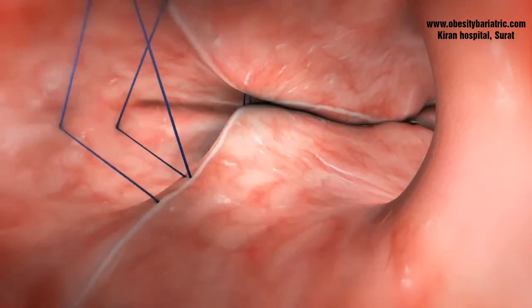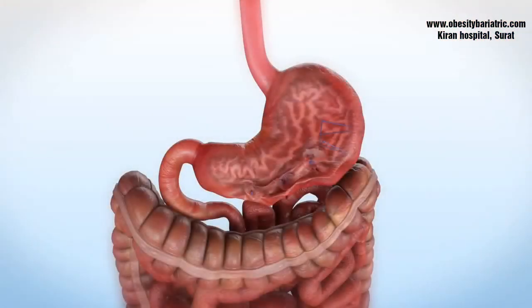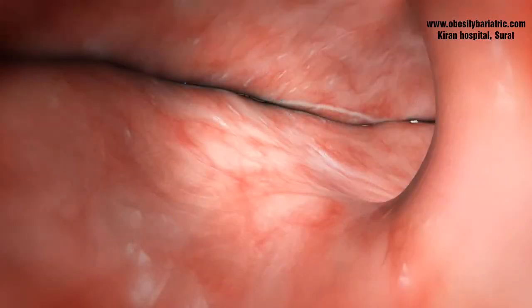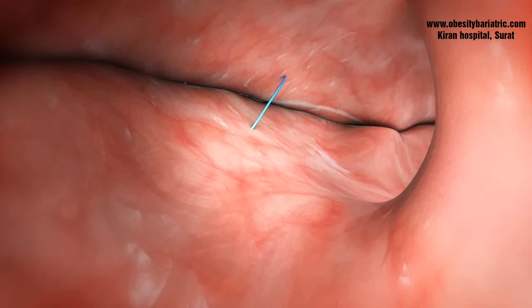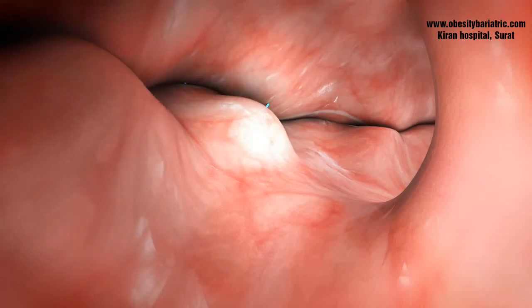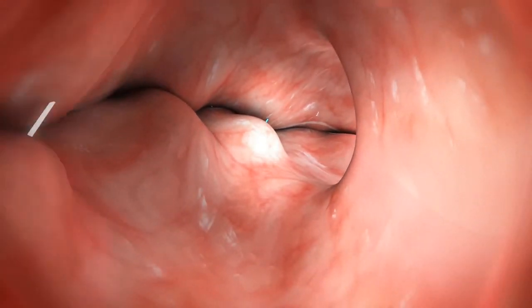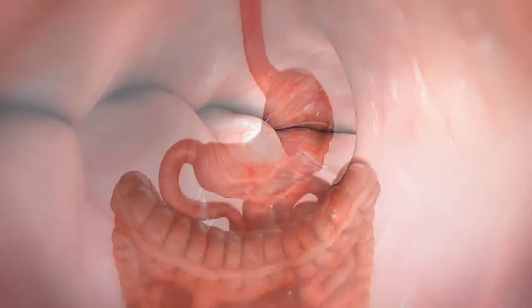Similar 4 to 5 triangular suture patterns are repeated along the greater curvature, which reduces the gastric volume significantly. To multiply and enhance the effect, just like in sleeve gastrectomy, a second layer or row of sutures is then tightened, thereby further reducing the gastric volume. This extends just below the gastroesophageal junction up to the Z-line.